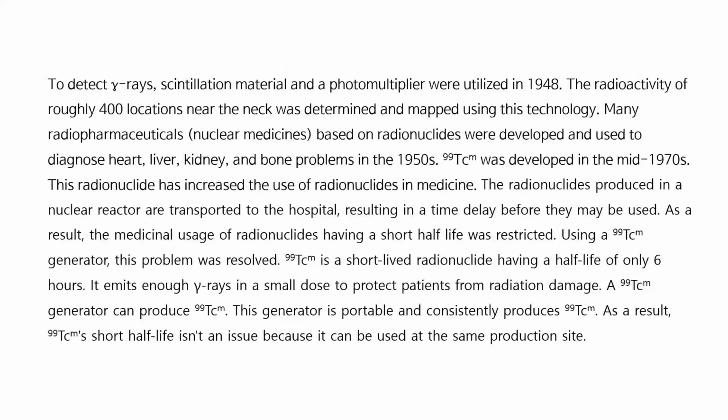To detect gamma rays, scintillation material and a photomultiplier were utilized in 1948. The radioactivity of roughly 400 locations near the neck was determined and mapped using this technology.